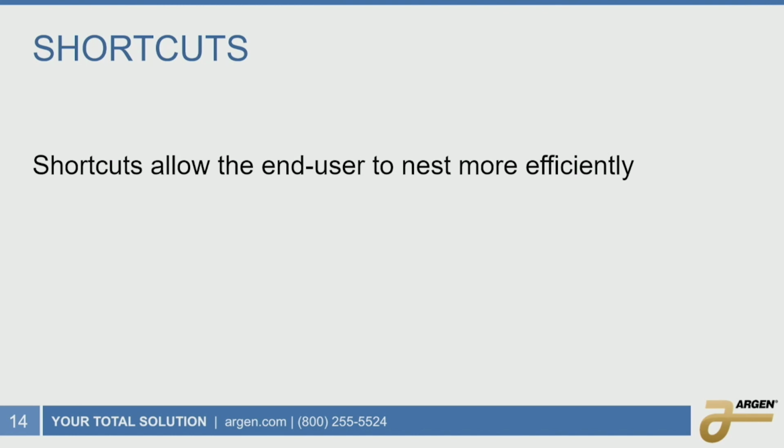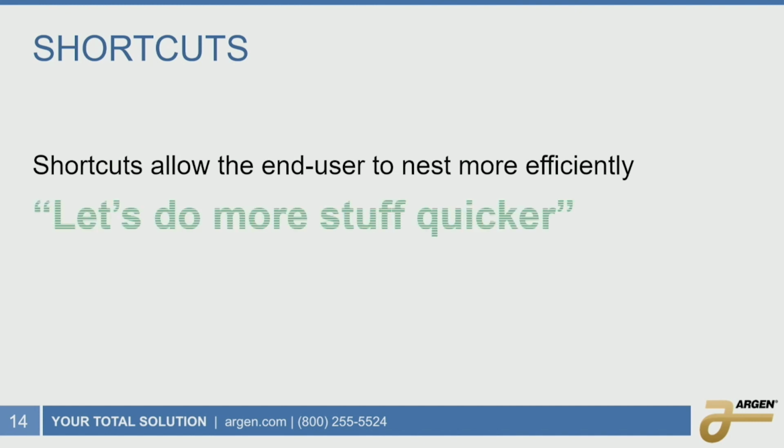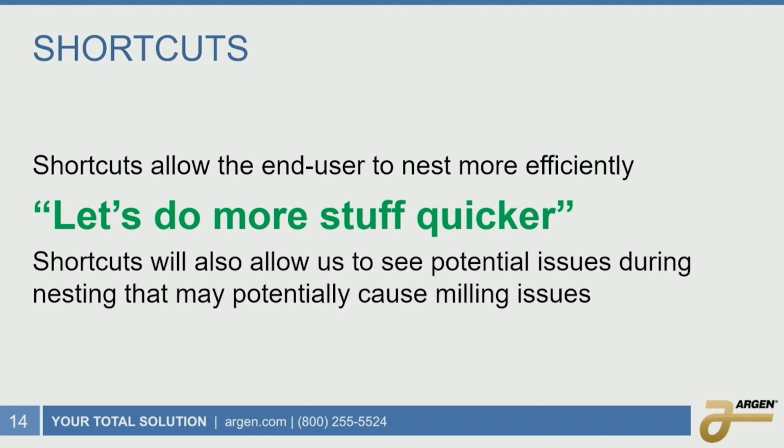Shortcuts. So shortcuts allow the end user to nest more efficiently, which is the whole purpose of this talk. What we're trying to do is let's do more stuff quicker. Okay, that's what we're trying to promote here. Shortcuts will also allow you to see potential issues prior to milling so that you can change whatever you need to within Millbox to avoid having these errors.